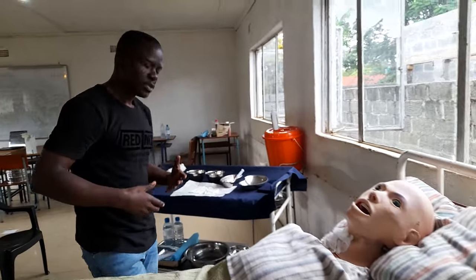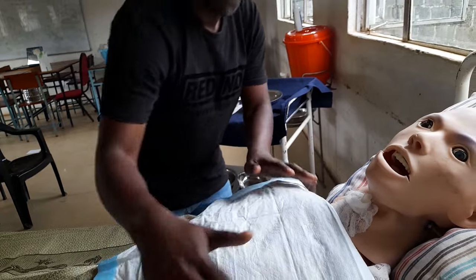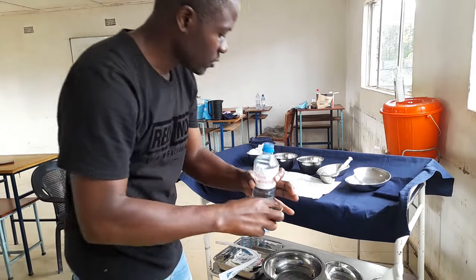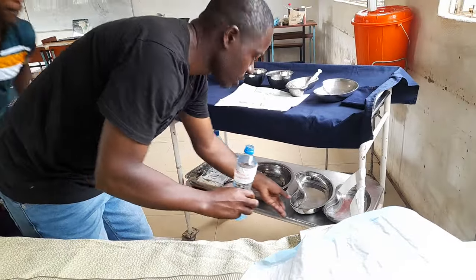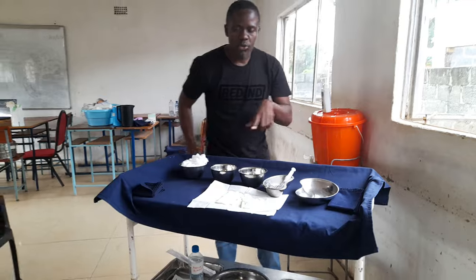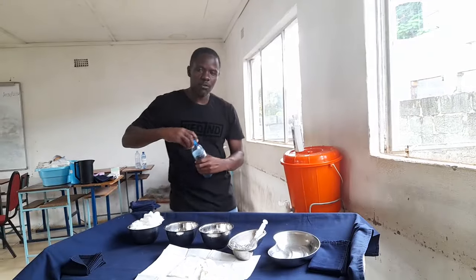Go to the bottom shelf and get the incontinence sheet, then place it under the patient so you don't soil the linen. After that, prepare the solutions: first pour sodium bicarbonate into the receiver, then pour normal saline into both galley pots. You will see the use of each as we go on.